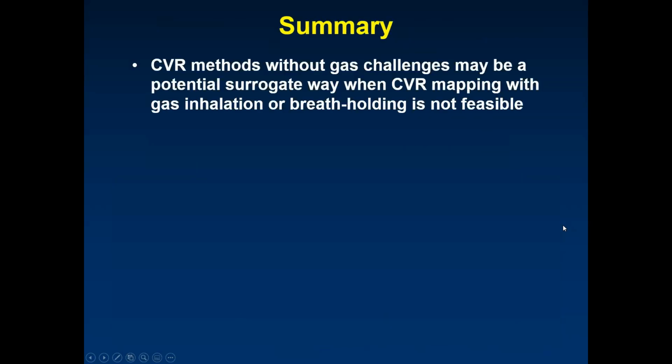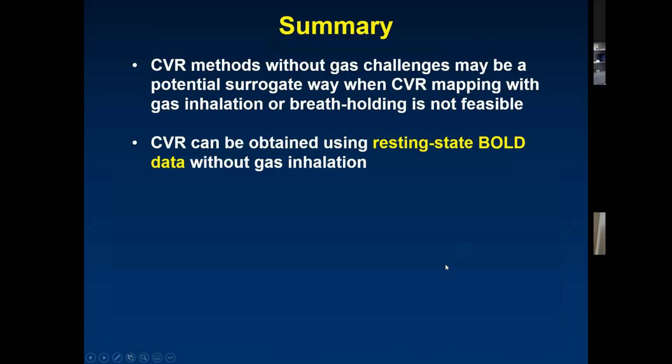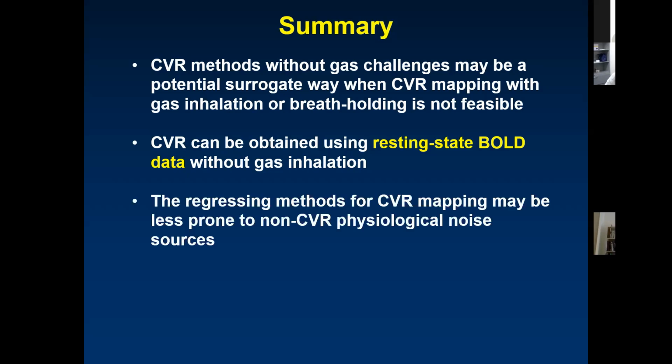So in summary, I have shown that CVR methods without gas challenges could be a potential surrogate when CVR mapping with CO2 inhalation or breath holding is not feasible. And CVR can be obtained using resting state BOLD data without gas inhalation.